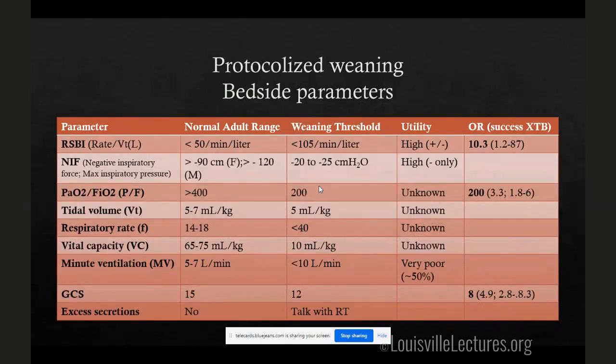This happens sometimes when patients are on synchronized intermittent mandatory ventilation but they're not sedated. And that makes sense, right? Because if they can feel themselves breathing, the vent is giving them a set breath, and they're trying to take their own breath, so their lungs build up like a balloon. This can give you a pneumothorax. So be very careful and look at these patients. Simulate it yourself. Feel what it feels like. It's very uncomfortable.